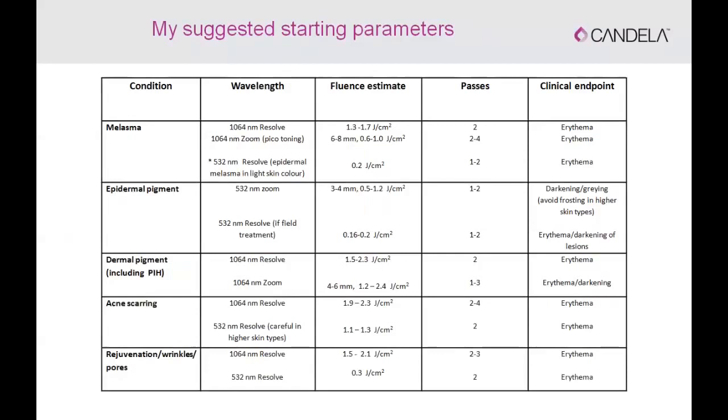So I hope that this table gives you an insight into how I approach the settings with the PicoWay, but feel free to submit a question at the end if anything is unclear.